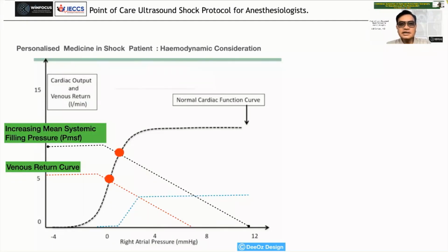But in most ill patients that we see, those patients that have a pre-existing cardiac problem, cardiomyopathy, heart failure, or other comorbidities, there is an increased risk of limited physiological, cardiac, and respiratory reserve. And this is just an example in those with impaired cardiac function.